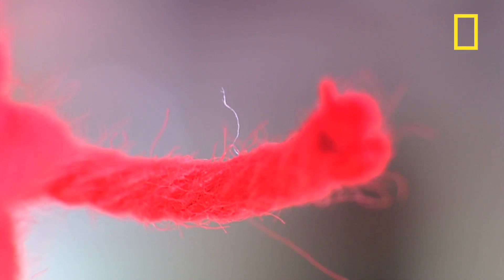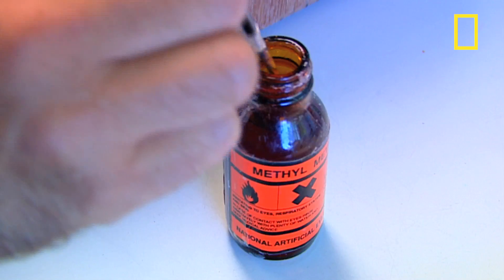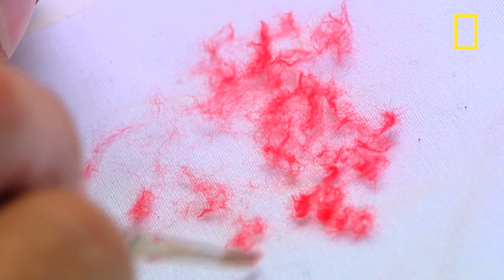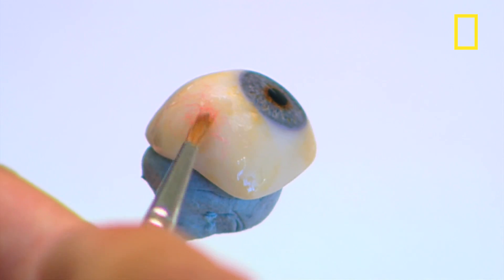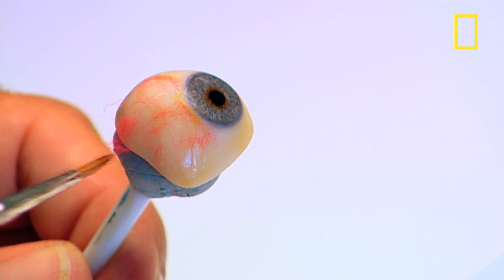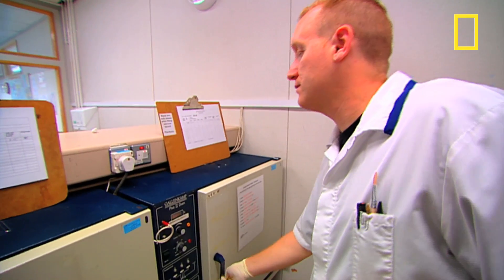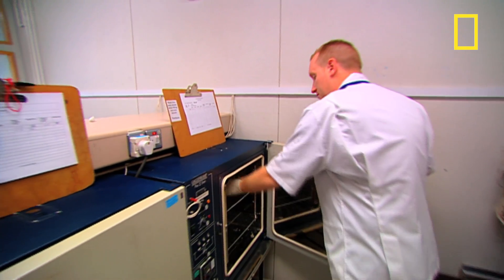This embroidery silk is used to replicate the veins of the eye. The thread is separated into individual fibers and applied with an acrylic varnish. Just one centimeter of this thread will provide enough fibers to make over 100 eyes. A coat of clear acrylic varnish is applied over the top of the eye and it gets oven cured to seal it.